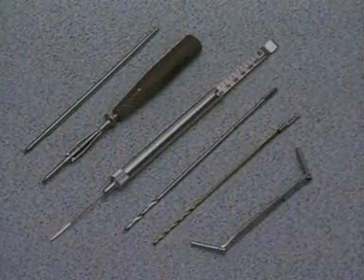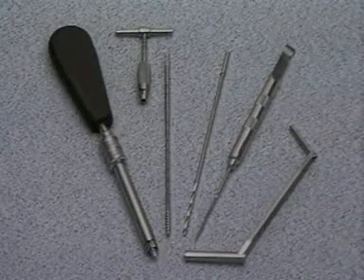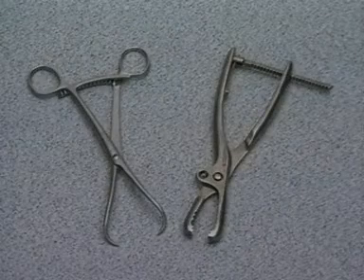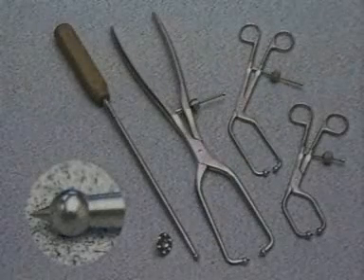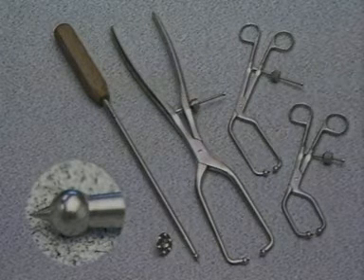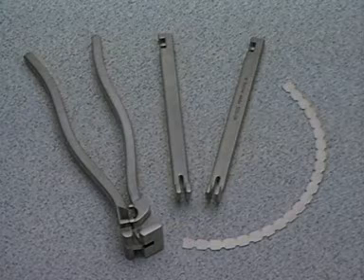For this exercise, we'll use part of the 3.5 instrument set. These are needed instruments for insertion of the 6 mm Schanz screw. We also use the pointed reduction forceps and the Farabeuf clamp. These are the necessary pointed ball-tipped instruments, bone-holding rod with spiked disc, and 3 various pelvic reduction forceps. The template serves as a model for bending the plate with the bending pliers for reconstruction plates and the bending iron.